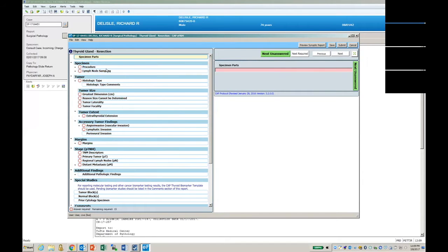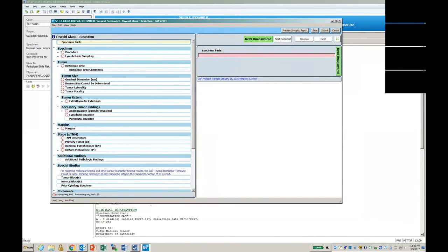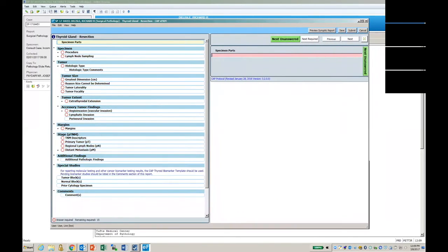The standard entry is this 2-panel entry, which has been an interesting thing for me, both in talking to other institutions and in seeing our pathologists go through this. It looks very different at first: you've got your data elements listed on the left side, but you're actually entering the data on the right side. Some pathologists at first, in my experience, thought that was very awkward and didn't like it, but within a matter of weeks, they love it now because it ends up being a very fast workflow. I think that's been Mike's experience too from what he told me.